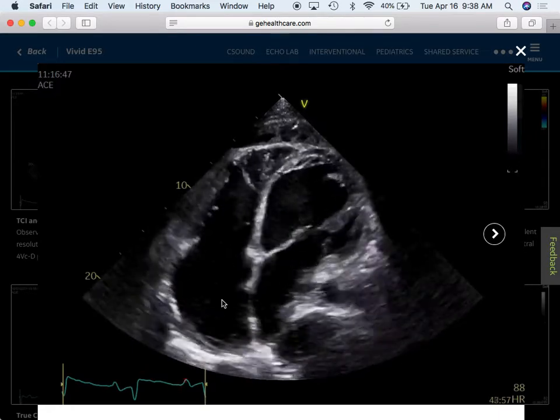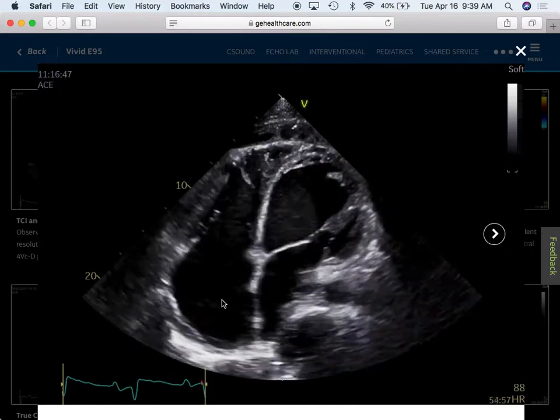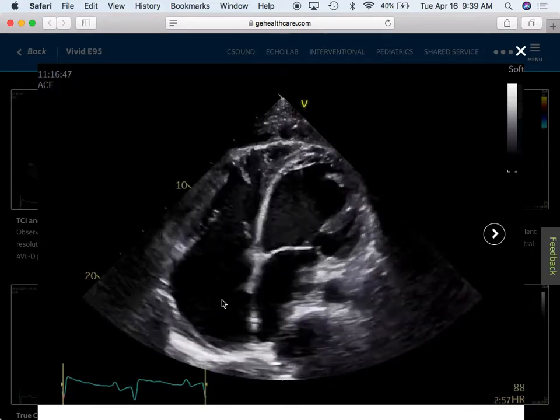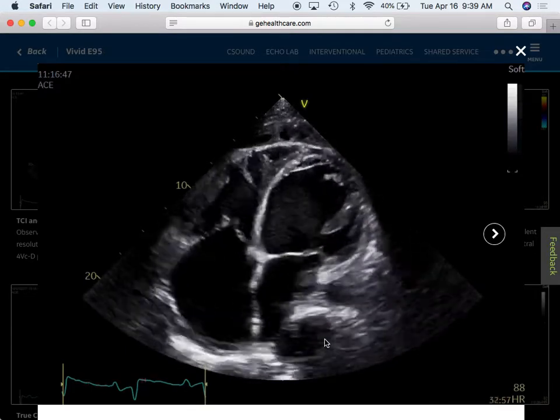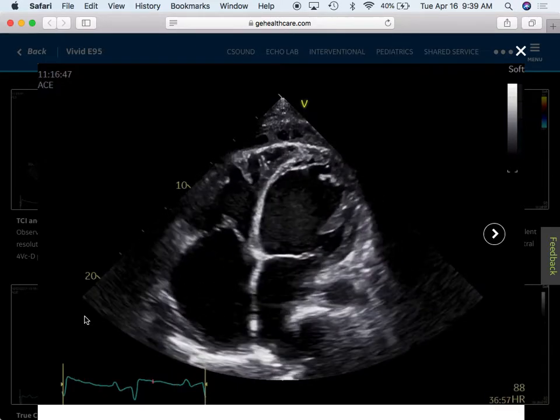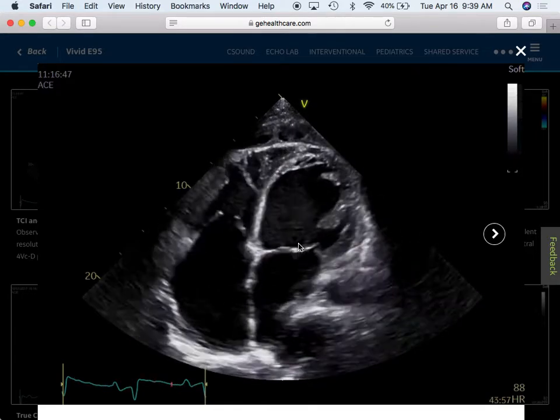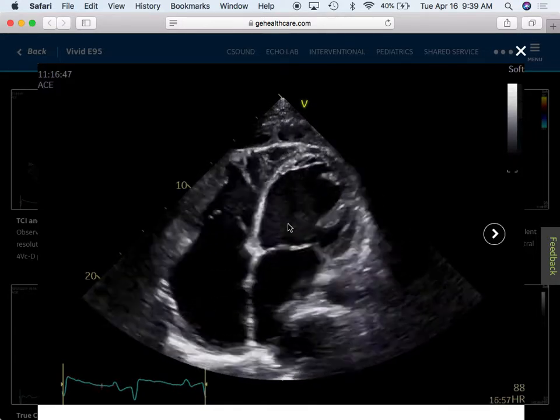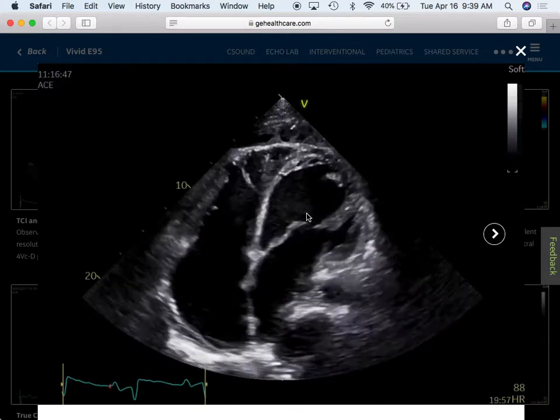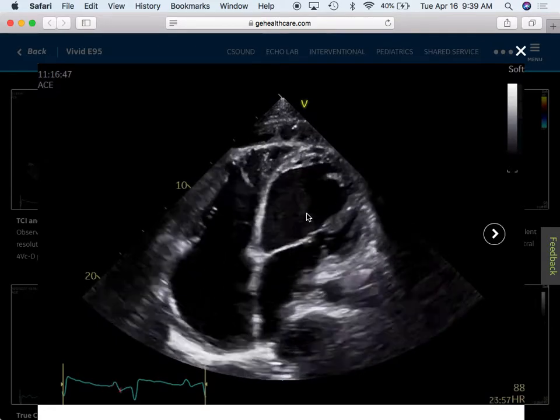And the great thing about echocardiography is this is done in real time, right? So you have the transducer in your hand, and the pictures coming up on the screen are what's happening right in front of you. So it's a pretty remarkable technique that way. It's a two-dimensional technique in the sense that you have this 2D field here, and obviously there's some kind of depth associated with each signal in this picture, and we'll take a look at how you figure out how thick that depth is.